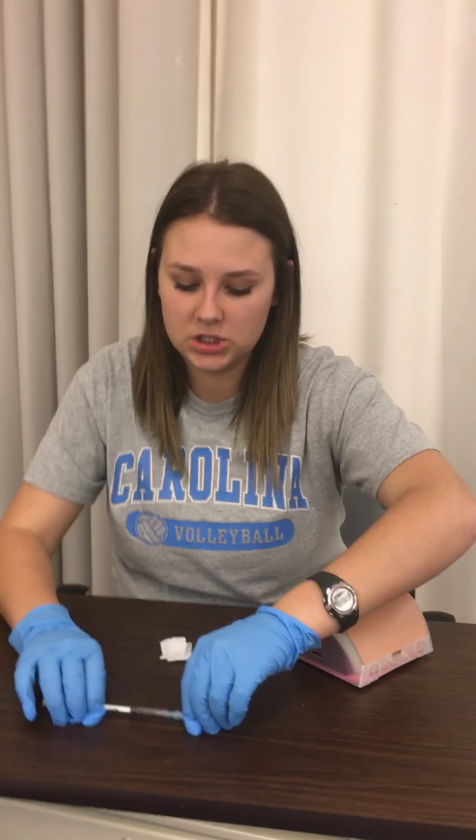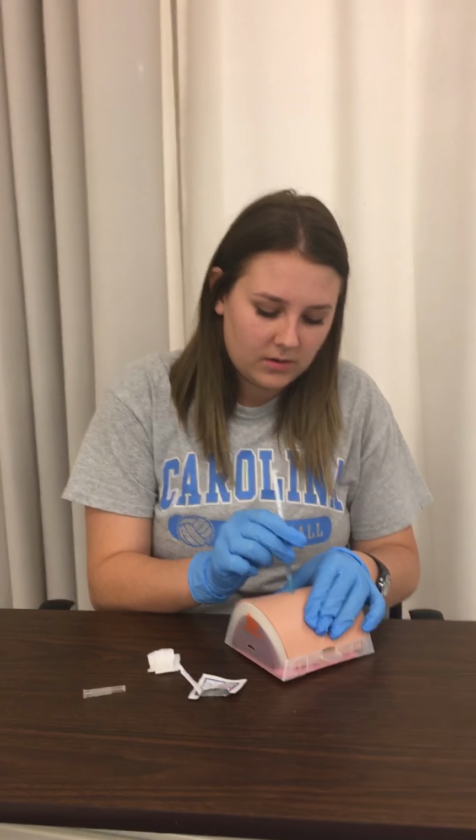You're going to get the medication. You're going to uncap that needle, and whenever you are giving the injection, you're going to pinch up an area of fat because it's sub-Q. And you're going to do a dart-like motion at either a 45 or a 90-degree angle, depending on the amount of fat. So we're going to say that this person is hefty enough for a 90-degree angle. So we're going to go real quick like that.